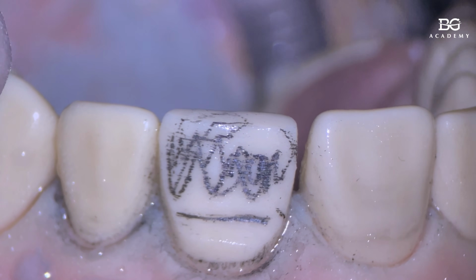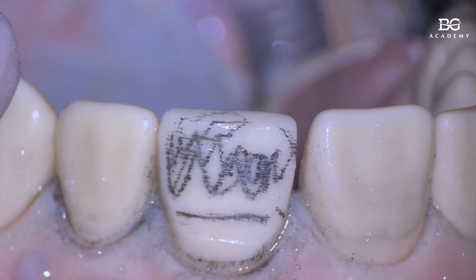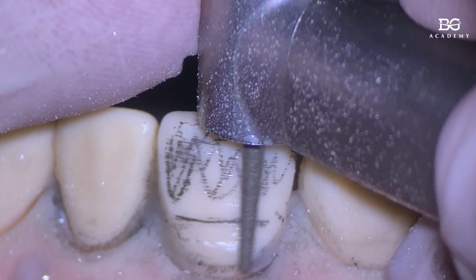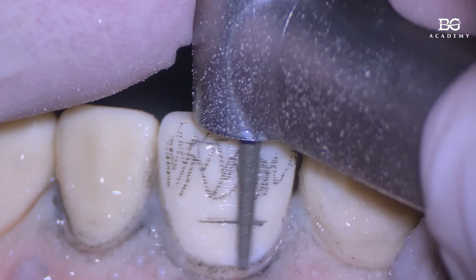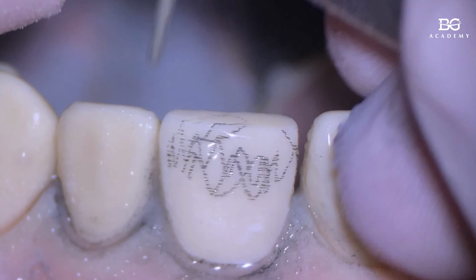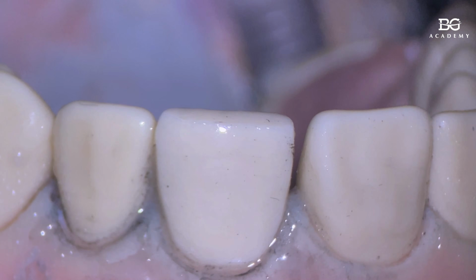And supragingival stage 1. We'll do our margin later on. And then stage 2, low speed, red bur, the retraction cord and so on. So I place it supragingival. That's it. No lines, no grooves.